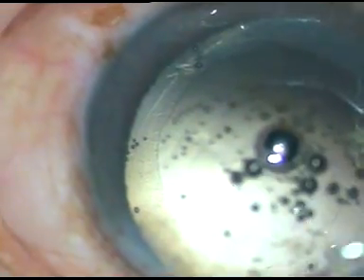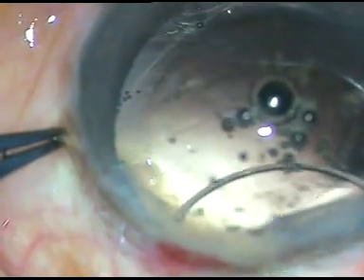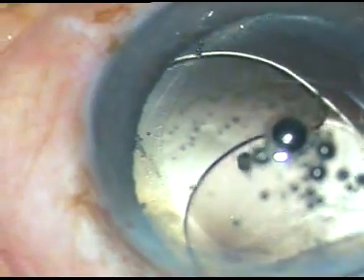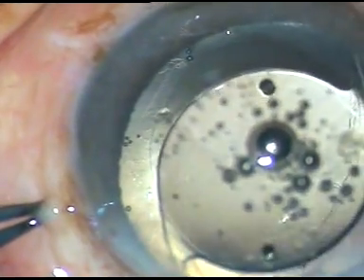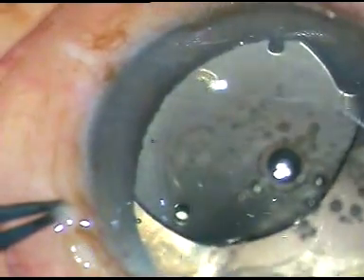In this case, I'm implanting a PMMA lens, a 6 mm optic PMMA lens, in the sulcus. Here it goes. Both the haptics are placed over the anterior capsular rim.